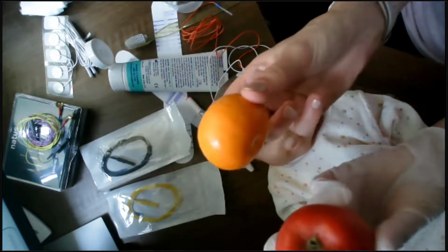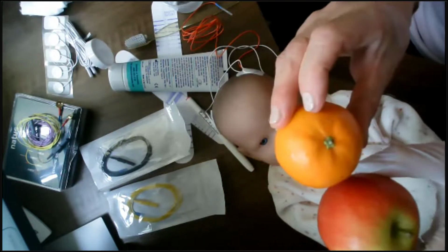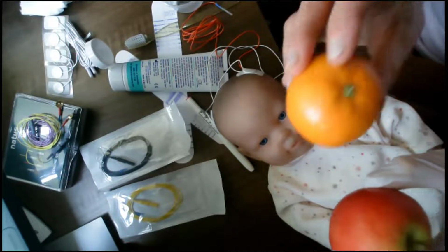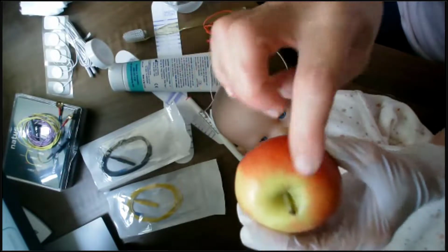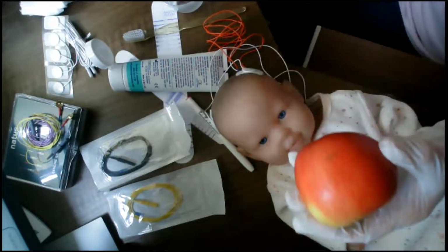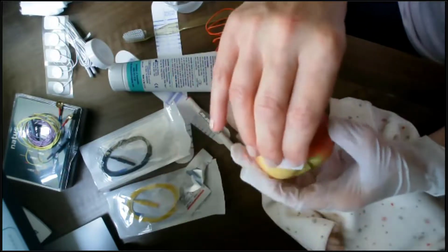And I have 2 pieces of fruit. You can choose an apple, an orange, a grapefruit, anything that has skin that you can insert a needle into. Now, because I fancy eating the orange after we've talked, I'm going to choose the apple. And I'm going to presume the apple is my baby's head. So I will presume I've done my measuring. I will take my alcohol swab. I will clean the baby's skin.